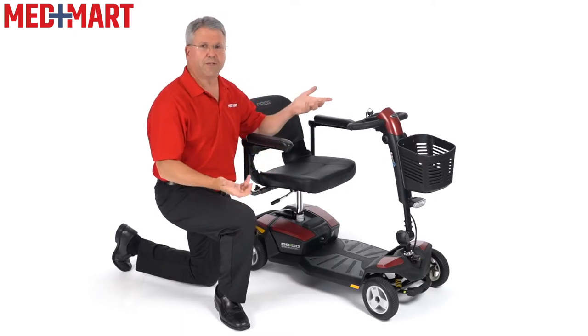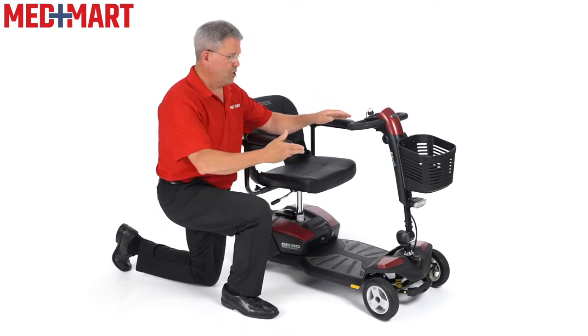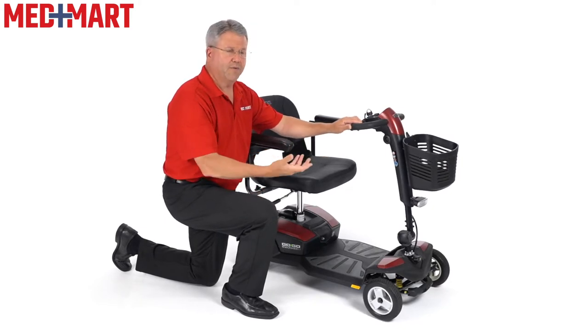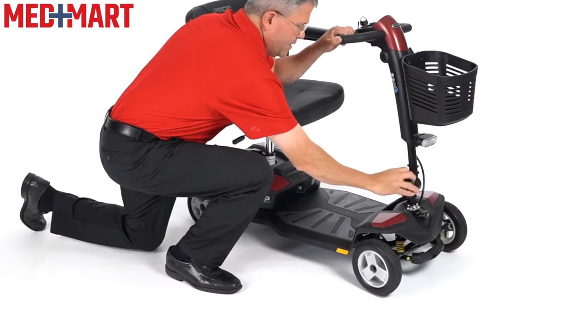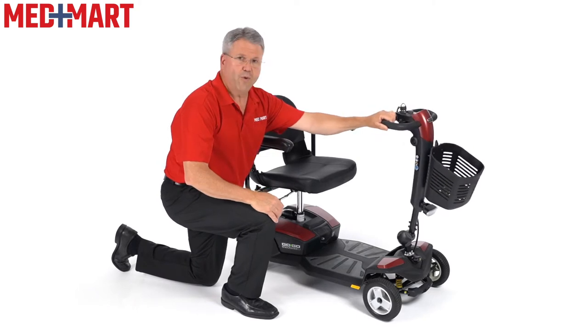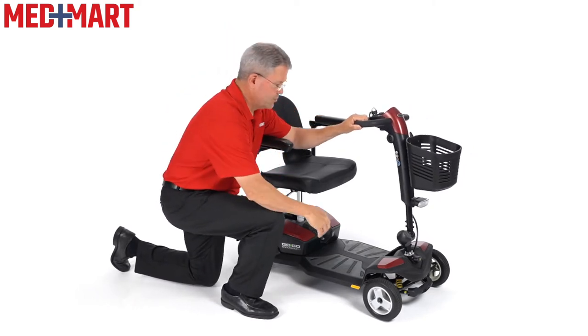One of them, as we already talked about in the previous video, is simply adjusting the tiller and making it easy. I'm going to show you one more time how you do it from the side view here. It is easy to do if you're sitting in there, depending on your mobility. Loosening that, I can now bring the tiller either closer to me or further away from me, which gives me a little more leg room depending on my situation.